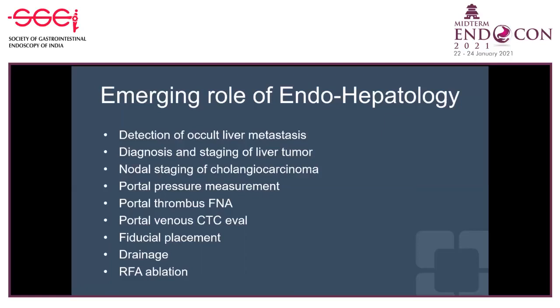Our center performs liver transplants for cholangiocarcinoma, and endoscopic ultrasound is used for nodal staging, with data supporting its utility for this particular indication. Again, we have an emerging role for portal pressure measurement. There are data on portal thrombus or tumor thrombus by needle aspiration, and use of portovenous circulating tumor cell evaluation for staging of the tumor and for prognostication.